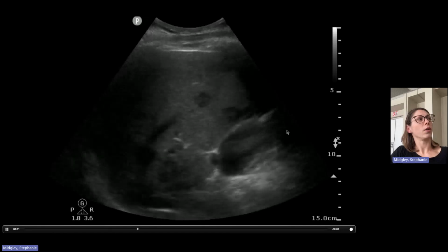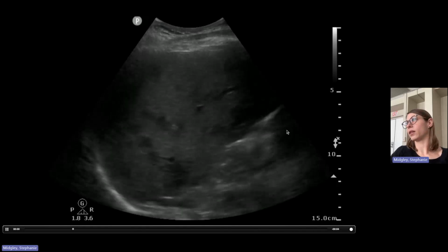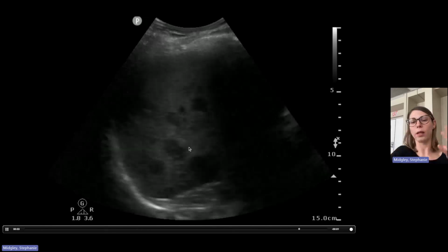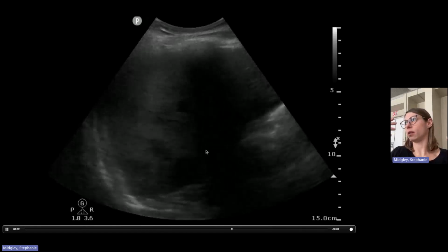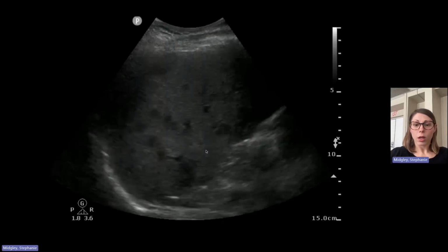Putting the pieces together, he'd had a cough for a while, he'd had some weight loss, he had pleuritic upper right abdominal, right-sided chest pain. This ended up being lung cancer with widespread metastasis. And this actually did change his workup a little bit, because he went from getting a CTA to basically a full pan scan for a metastatic workup. So common sources of course are colon cancer, breast cancer, pancreatic cancer, lung cancer.